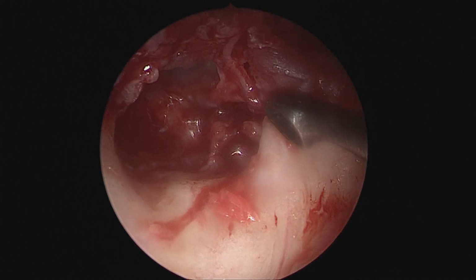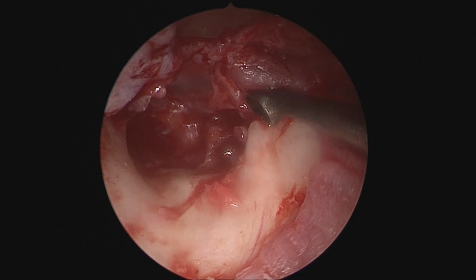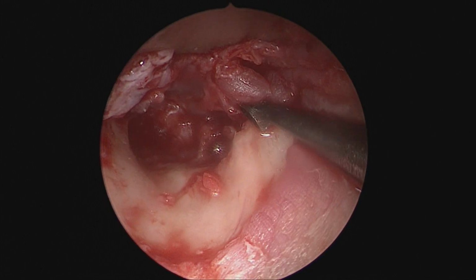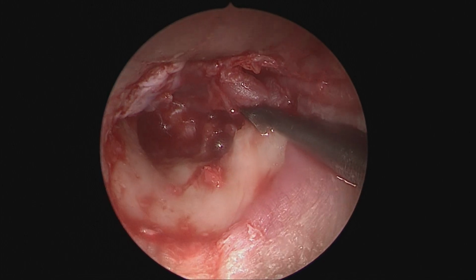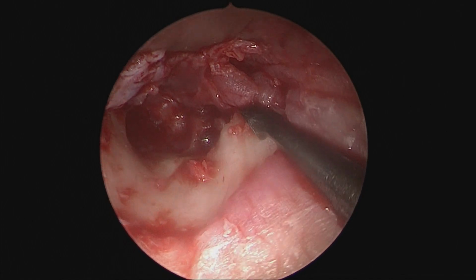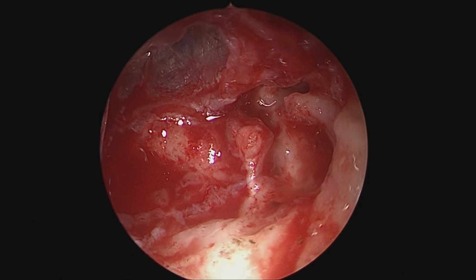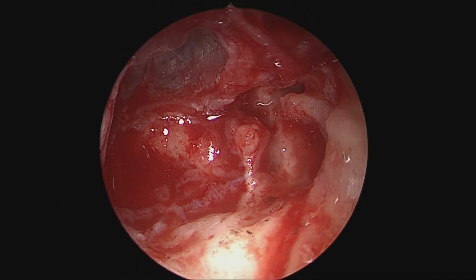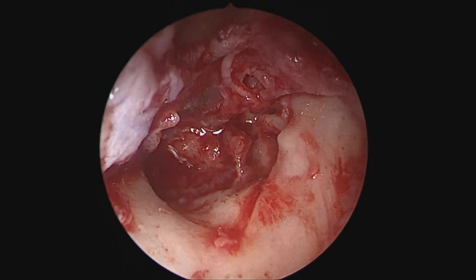Now what we'll do is a little bit of curetting to be able to conclusively see and examine the posterior superior region. Also, that slight curetting would help us extract the incus more carefully, because if we try to remove the incus within a very small space, that could possibly traumatize the stapes.